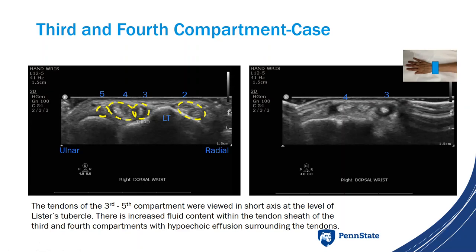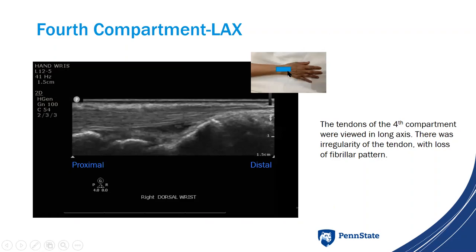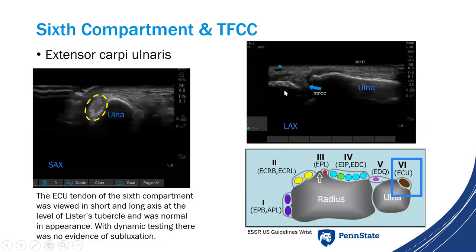I don't always look at long axis in a dorsal wrist exam unless there's an abnormality in short axis warranting further evaluation — which is the case here. Rotating the probe to long axis, with proximal to the left and distal to the right, we look at the fourth compartment tendons. In long axis, there is loss of the normal fibrillar nature of the tendons, indicating tendinopathy. Sonopalpation did not elicit pain, but this is another useful part of the ultrasound exam.